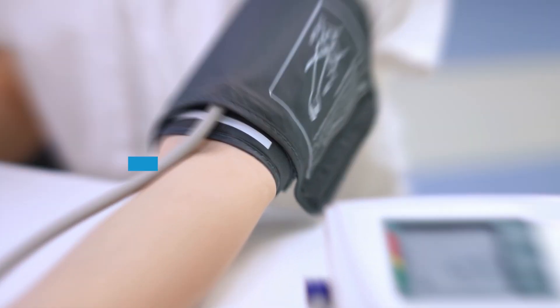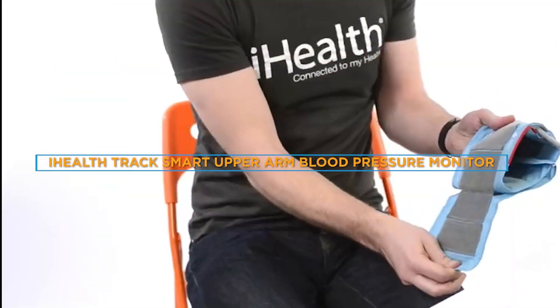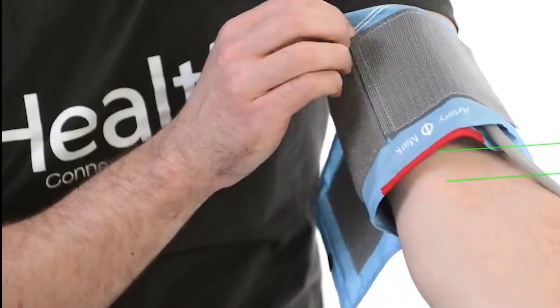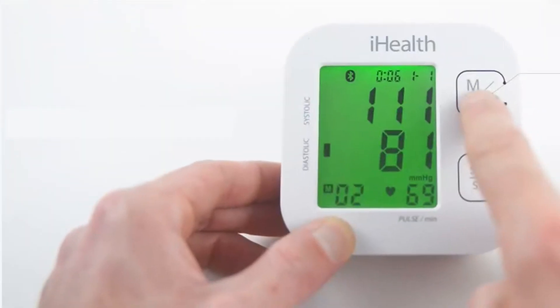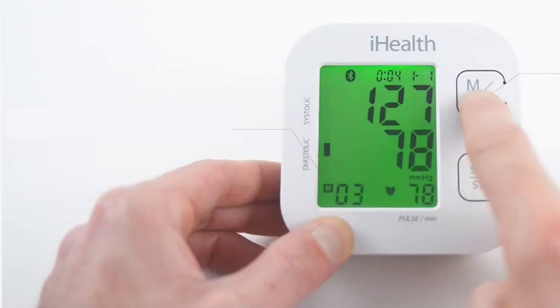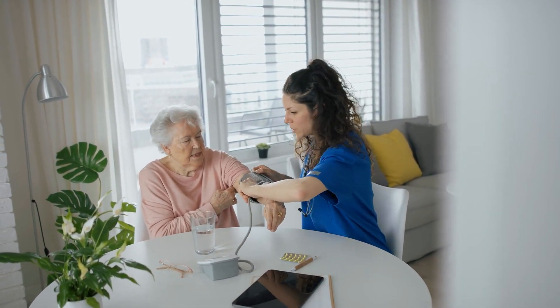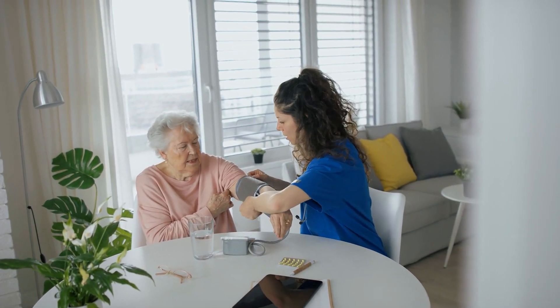Hello and welcome to this video review of the iHealthTrek Smart Upper Arm Blood Pressure Monitor. If you are someone who is conscious about your health and well-being, then you know how important it is to monitor your blood pressure regularly. And with the iHealthTrek Smart Upper Arm Blood Pressure Monitor, you can do just that with ease and accuracy. Now let's dive into the depths of this review.